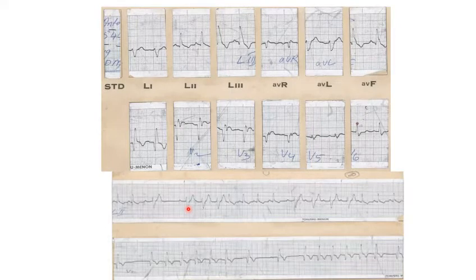A clue: whenever you find that in the chest leads the QRS morphology remains the same, while in the limb leads the QRS morphology is changing, it is mostly due to intermittent left anterior fascicular block and left posterior fascicular block. With intermittent anterior and posterior fascicular block, you can get variation in the QRS morphology in the limb leads, but in the chest leads they do not change, because the maximum change that can happen is shifting from left axis deviation to right axis deviation, and that will not affect the QRS morphology in the chest leads. So if you find an electrocardiogram like this, where the chest leads show only a normal pattern with no change at all, while in the limb leads the morphology is changing from right axis deviation to left axis deviation, then you should conclude that most likely it is intermittent left anterior fascicular and left posterior fascicular block.